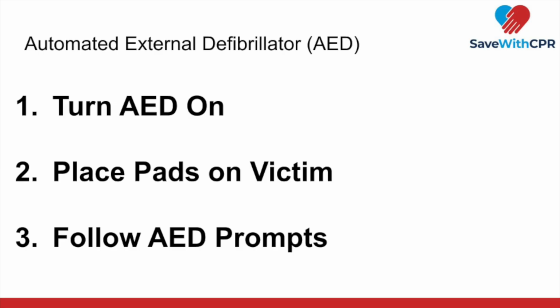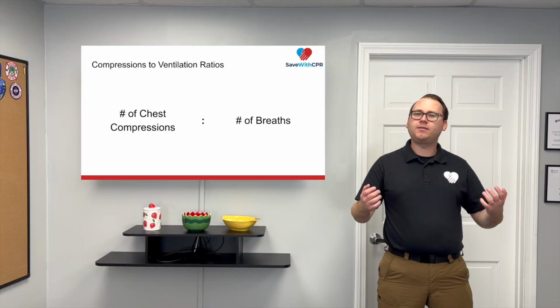It's important to recognize that the AED is going to analyze the cardiac rhythm of the patient, and not in every case will a shock be delivered. In some cases of cardiac arrest, the AED will advise no shock, and advise for you to continue chest compressions. This is completely normal.